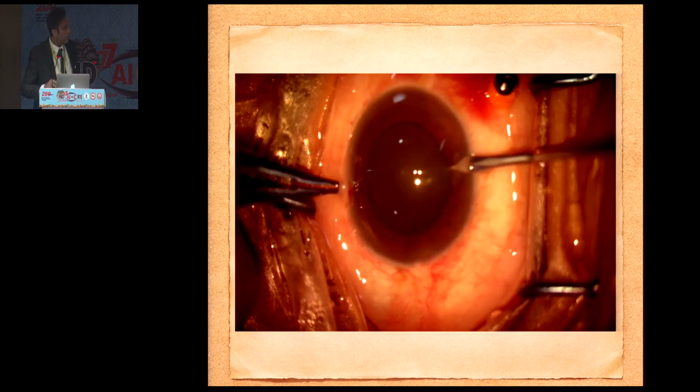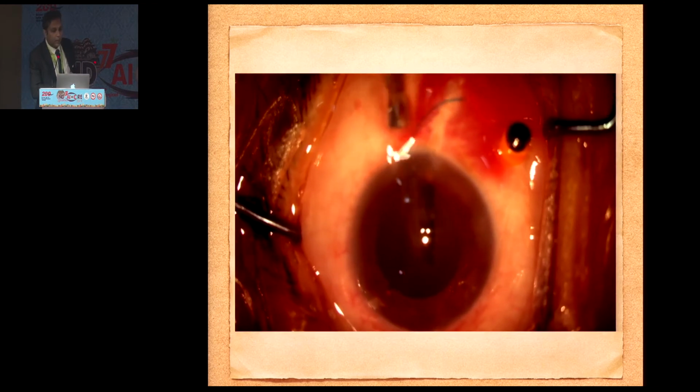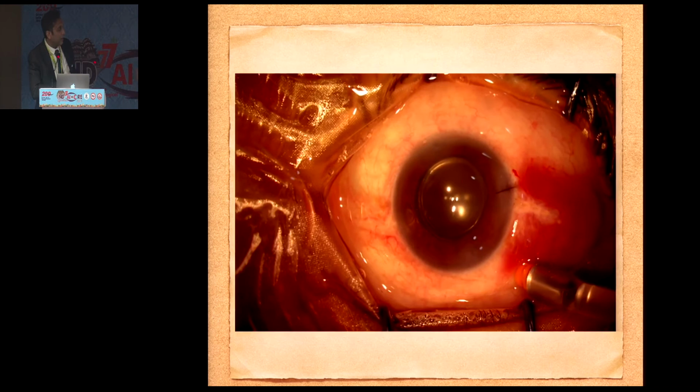I do a lot of phaco-vitrectomies these days because more than 50 years of age is the most common age group, and these patients eventually develop cataract. So placing an IOL is very beneficial. It gives you a clear view, and the membrane dissection is absolutely seamless.